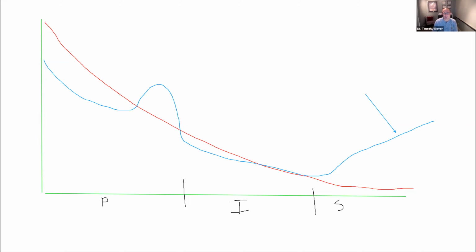And we know from our earlier discussion that when we see that rise there, we're going to get more anxiety. But what the person finds is that when they use marijuana, the anxiety seems to subside. Why is that happening? It's because the marijuana causes a significant rise in these brainwaves right here, which is fascinating.